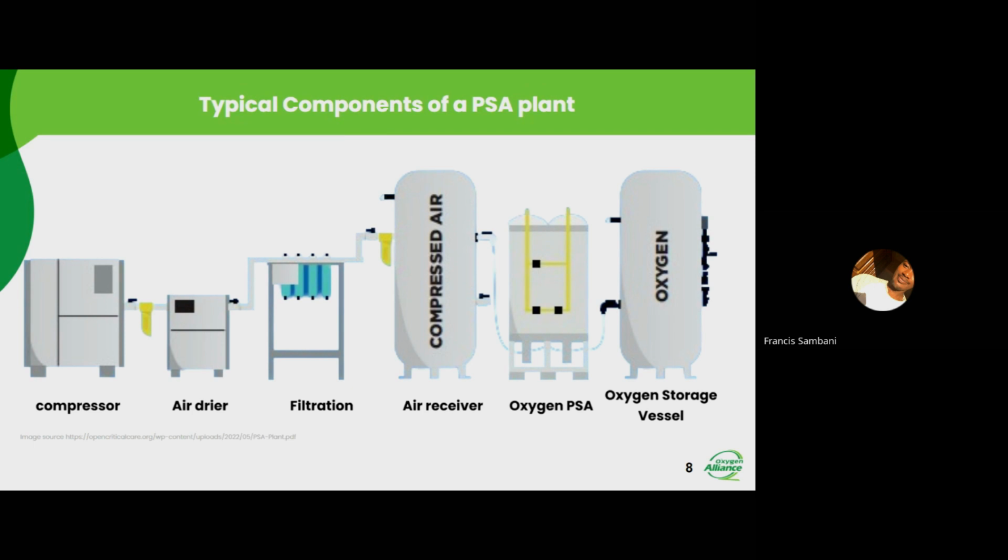And once that is reached, what you do next is you close all the valves of the cylinders. Once you close the valves of the cylinders, you open the vent valve on your high pressure filling manifold, because you still have some air left in your pipeline. So you open the vent valve to get rid of that pressure inside, and you vent out that pressure.